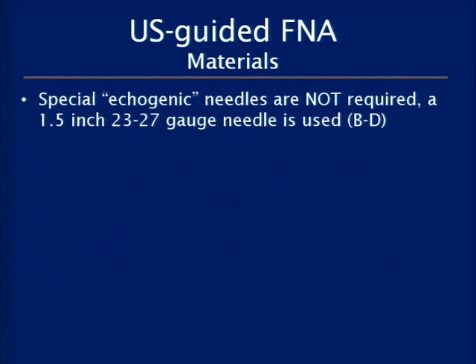So when you do a biopsy, you don't need any special tools. You don't need echogenic needles or anything like that.